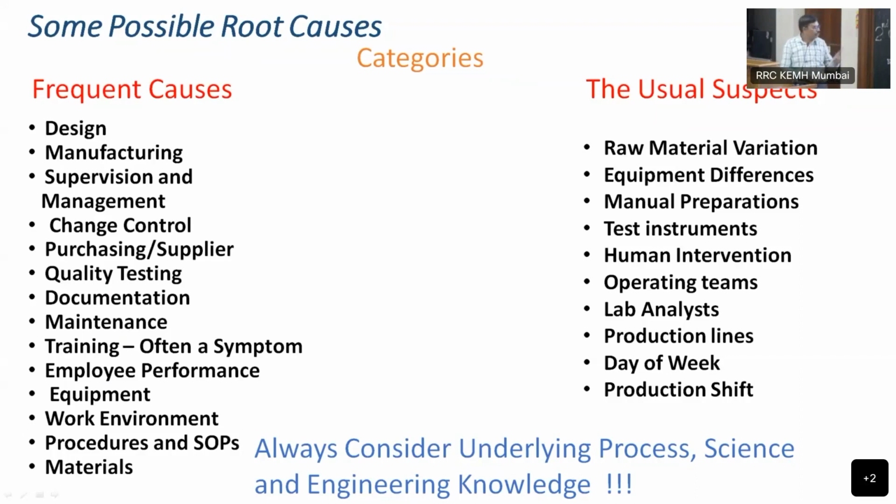Okay. Second, equipment. There are so many issues with the equipment. Say there are two equipments. For example, there is one machine, and I put the sample on it. It is aspirating the sample and immediately throwing it out, so that the technician will collect the sample immediately and load it to the other machine. Okay, that scenario is good now, rather than keeping the sample within the machine itself. Correct?